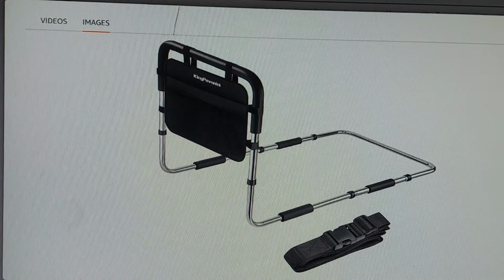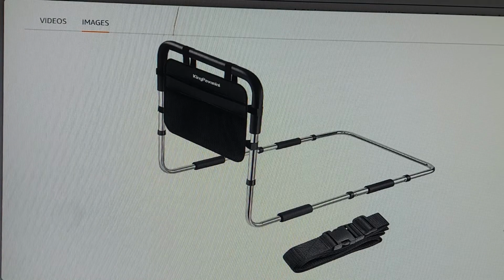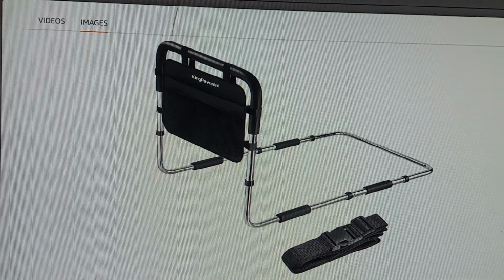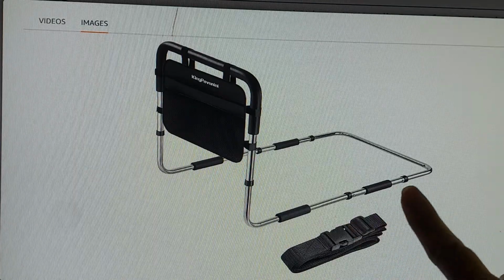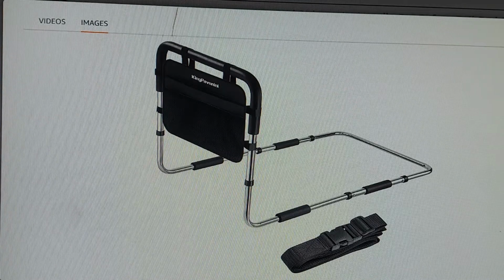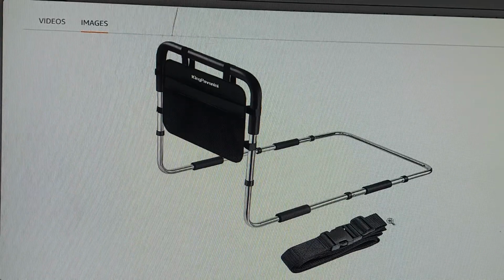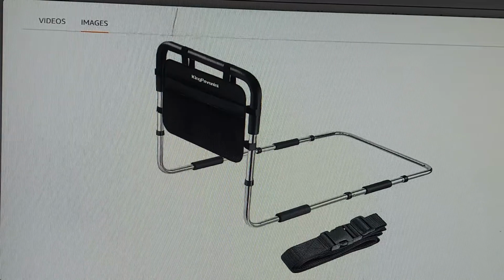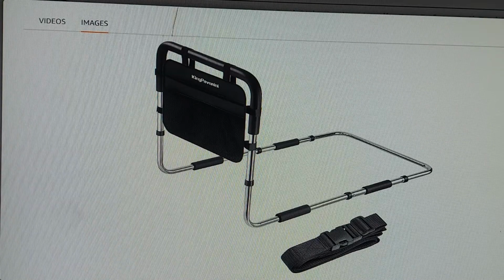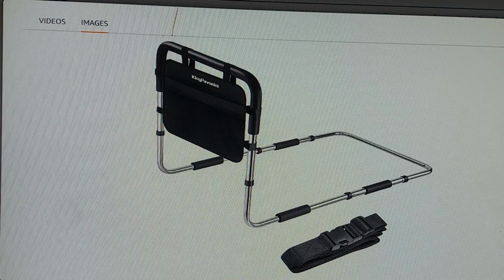Okay, so this is the product that we purchased. You'll see that it is kind of L-shaped. The bar that you see along here goes underneath the mattress. And this part goes beside the mattress. And we'll actually show you a video of it under our mattress and how it works. It does come with this strap right here that you can put in there. And I'm sure that for safety, it's recommended. So I'm not telling you it's safe without it. But we've been using it without it because we really didn't have anything to attach it to. But it's worked out great for us just having the weight of the mattress and ourselves on top of that mattress.